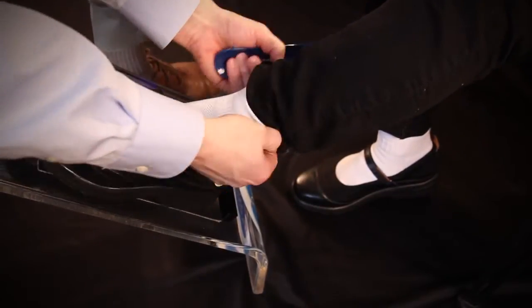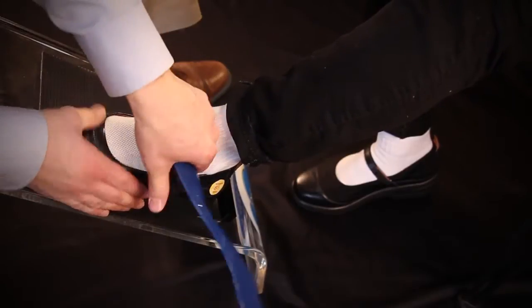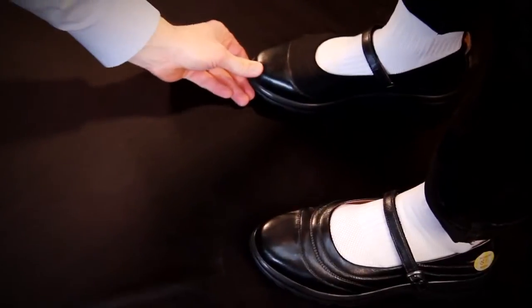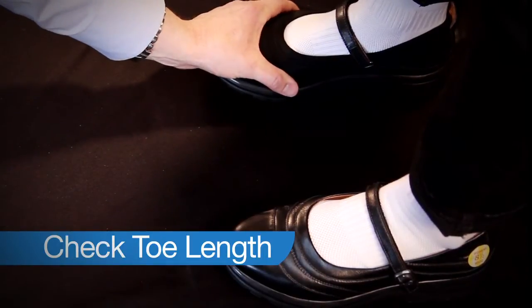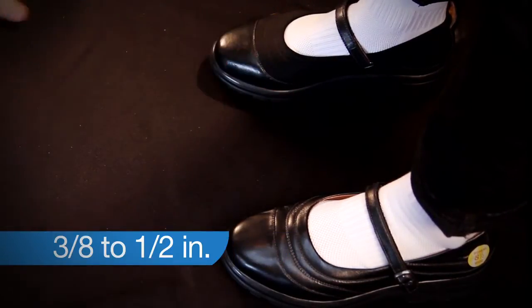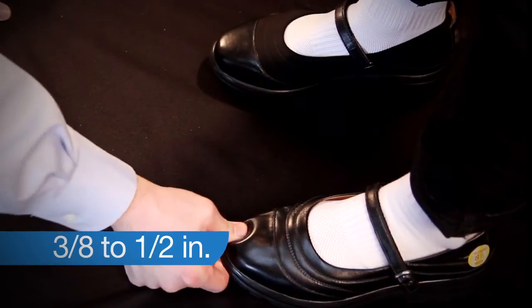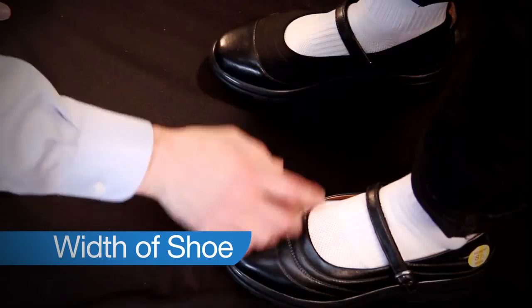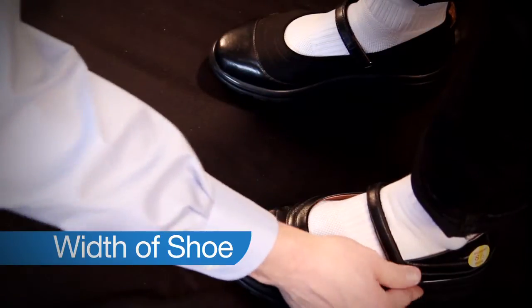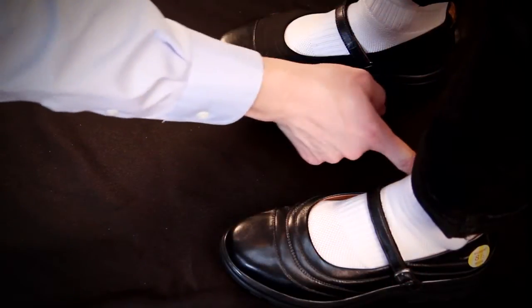Once the patient has put the shoes on, then we will have them walk around. To ensure the shoes fit appropriately, you want to first check the length of the toes, making sure there's at least 3/8 to a half an inch room from the end of the patient's toe to the end of the shoe. Then checking the width of the shoe, making sure her metatarsophalangeal joint is at the width of the shoe or the break point of the shoe.